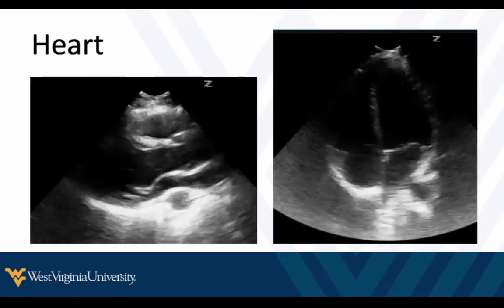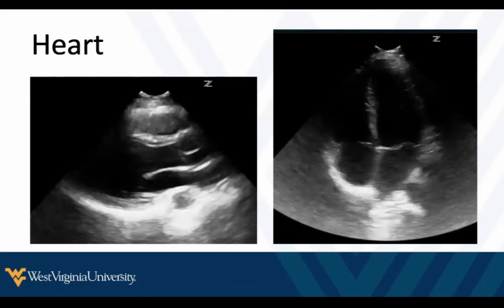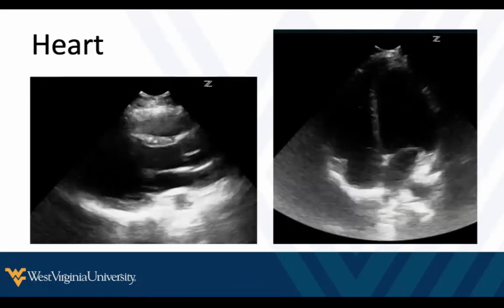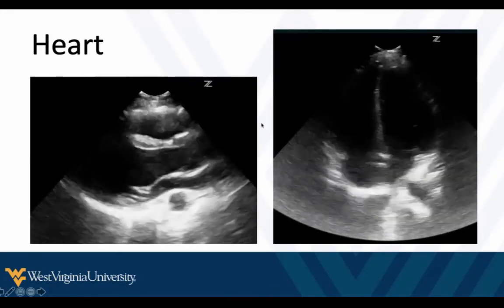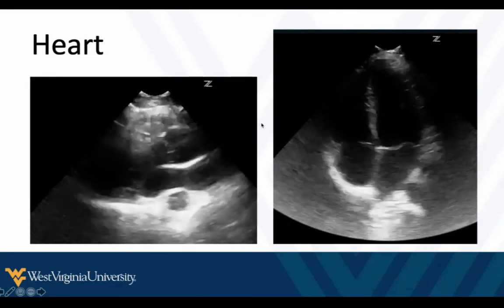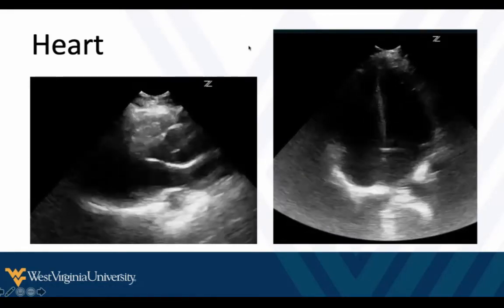And then, again, this is not a detailed look at the heart, but if you look at the heart, it looks kind of like a heart, right? It's a black and white beating heart. I just want you to get familiar with some tissues before we get into a lot of detail later on. So this is the heart, the left ventricle here. This is the left ventricle, this is the right ventricle, but we'll get more to that later on.